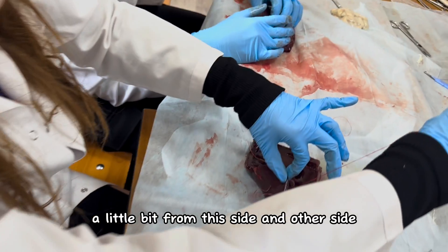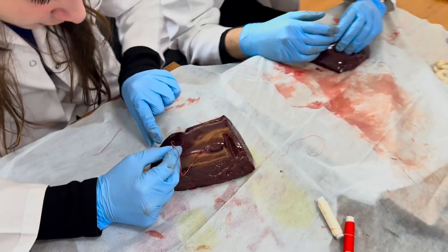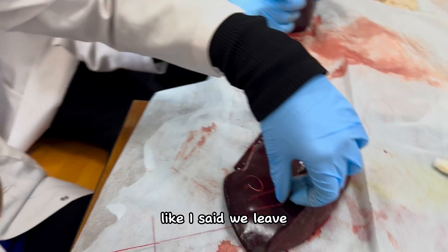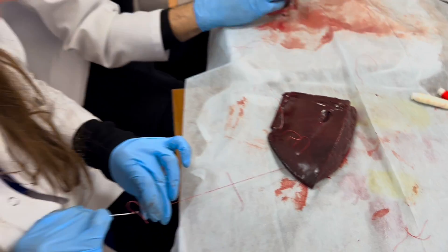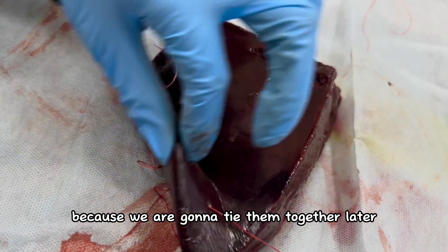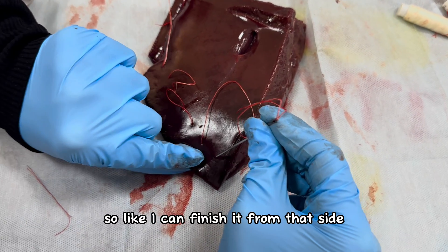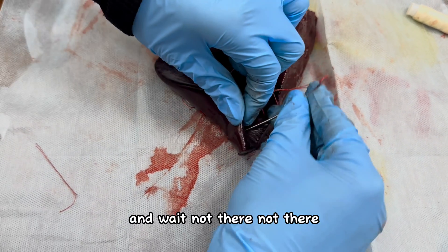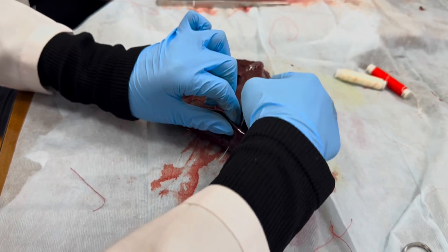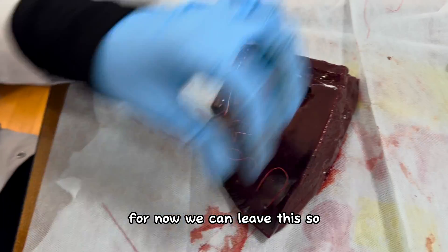So guys, we take a little bit from this side and the other side — we are not pulling it fully. We are imagining that we have cancer tissue here. So we leave a little bit like this, and we leave the same amount on this side because we are going to tie them together later. I think we can do one more — I can finish it from that side. We get this one also and we leave a little string here.